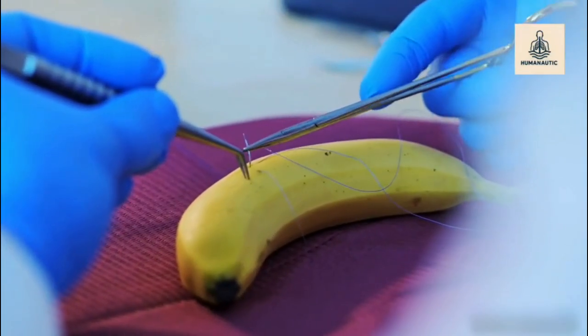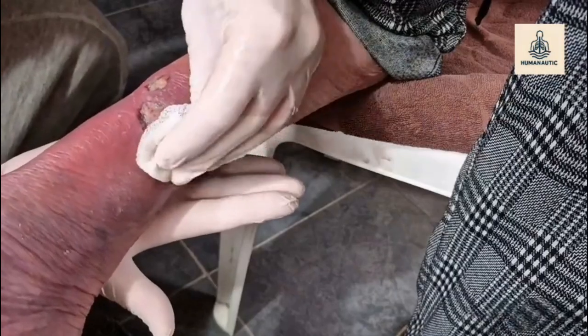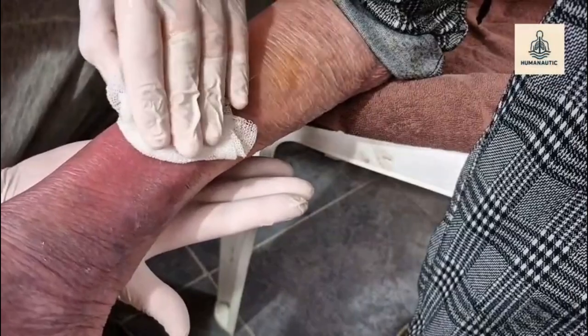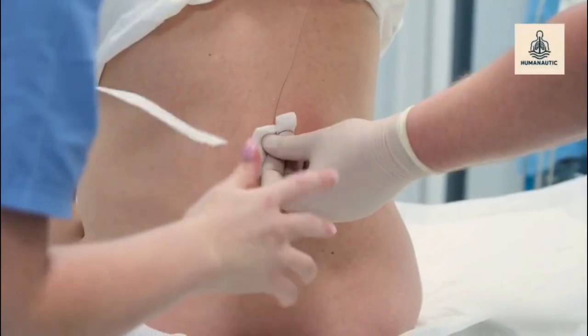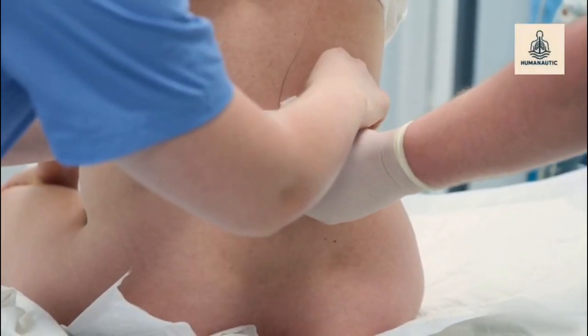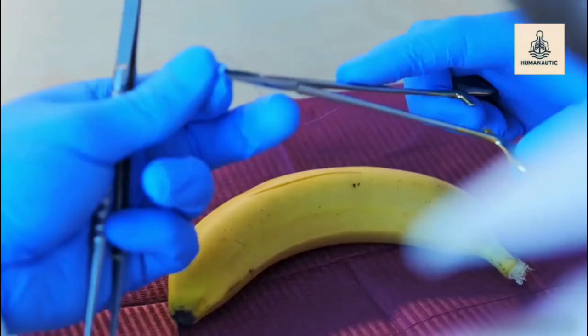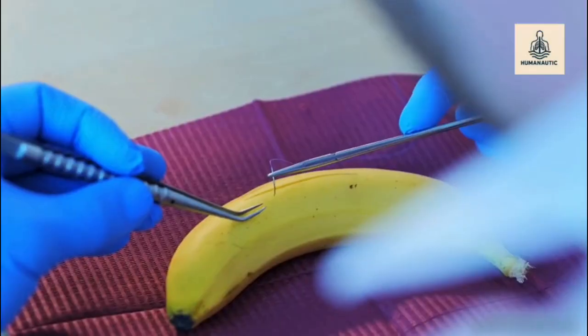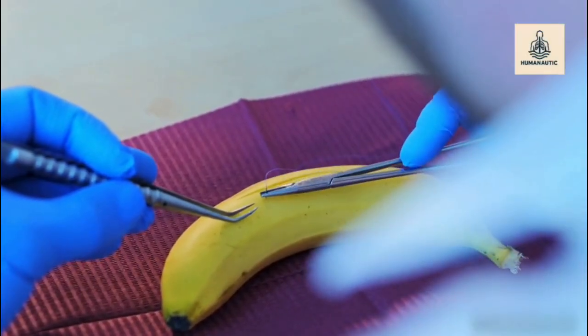Closing the wound. After the surgeon confirms that the surgical area is adequately controlled, the wound is carefully inspected. A drain may be placed to remove excess fluid during healing. The remaining tissue is then positioned appropriately, and the incision is closed using surgical sutures or other closure methods.